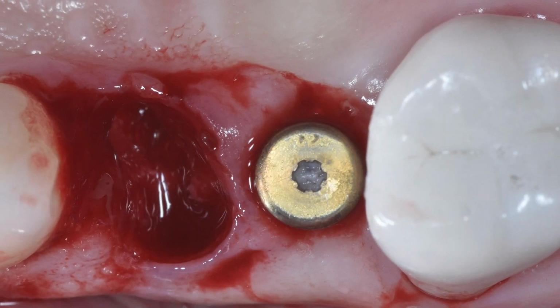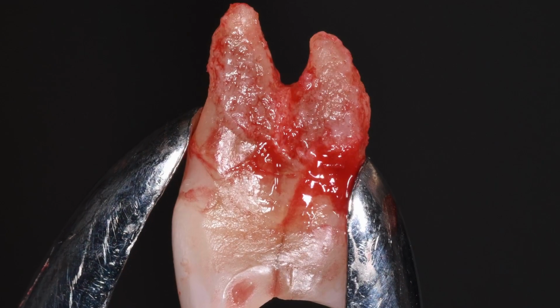When it comes to the surgical planning and the guides that I'm going to select for my surgery, it all comes down to the actual surgical site that I'm going to be working on. And what I am referring to with this is specifically 2 options that you're going to have. It's either going to be an immediate extraction implant, and when I have an immediate extraction implant case, I'm not going to use a surgical guide.